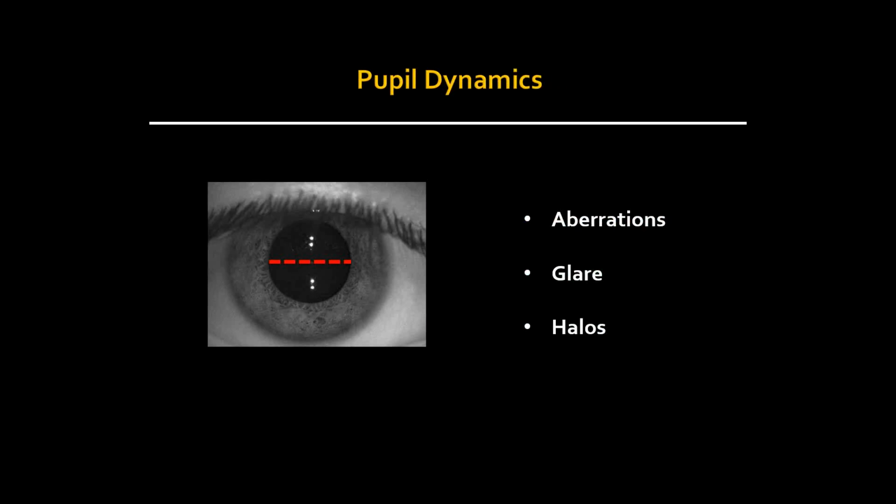They may complain of aberrations, of glare, of halos. By measuring pupil size through instrumentation, for example, here, you can record an accurate value of what the patient's pupil size is. Not only will it impact the fitting of contact lenses, specifically in this particular case for hybrid lenses, and like I said, going forward with scleral lenses, but also multifocal optics. We know that in order for multifocal optics to work, they need to line up with the patient's line of sight and be well centered on eye in order for them to appreciate clear vision. We already know that is something that we battle, and recording pupil size can help us understand down the road why our patients aren't necessarily getting the crisp vision that we expect them to. It also helps from an education standpoint for the particular patient.